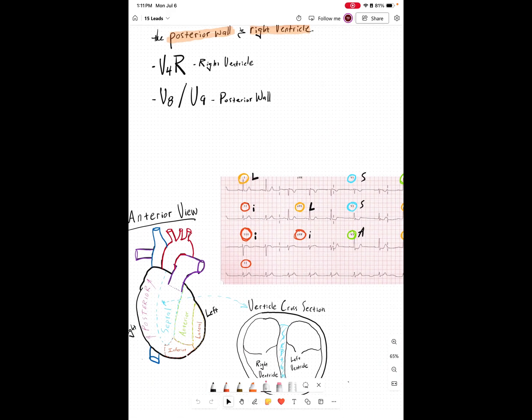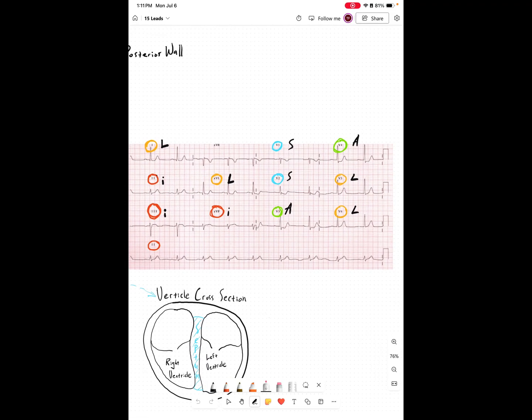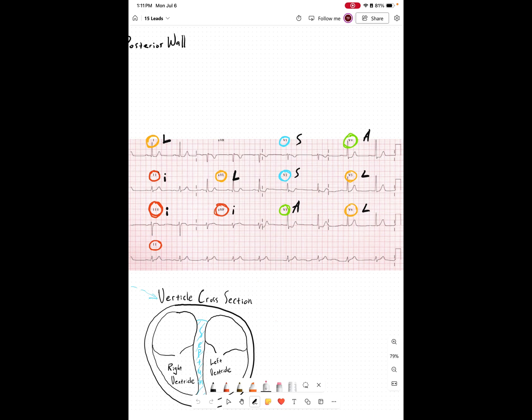All right. So here I have a relatively normal looking 12 lead. I have colored circles and letters next to each lead that correspond to different portions of the heart. A way to remember these portions in an organized, systematic way, kind of crude but effective, is "Lee, ass backwards, all." So I have lateral, inferior, inferior, lateral, inferior, septal, anterior, anterior, lateral.